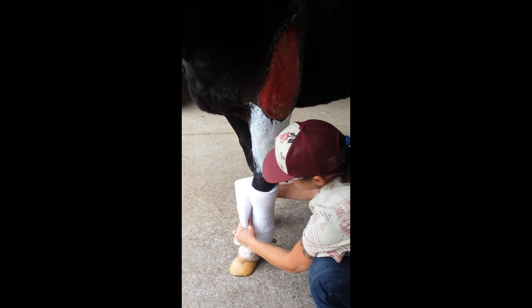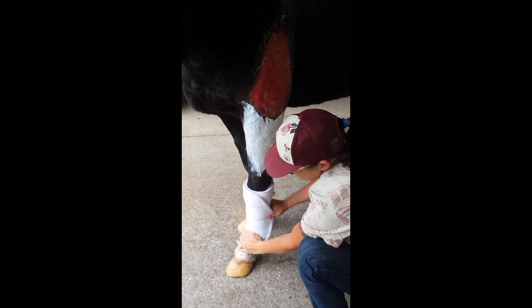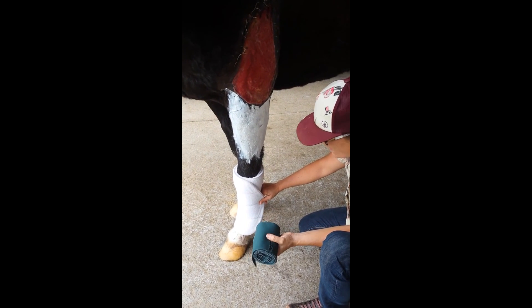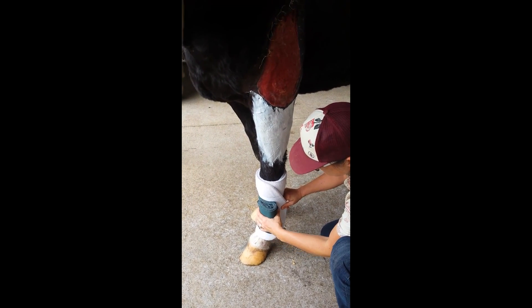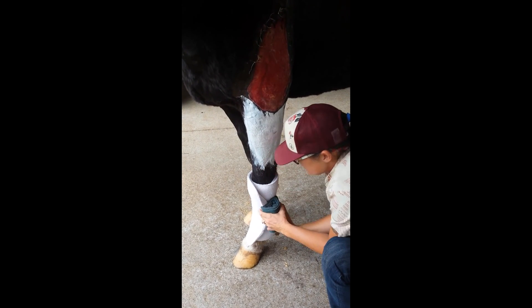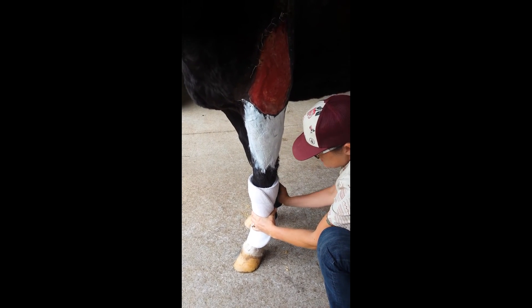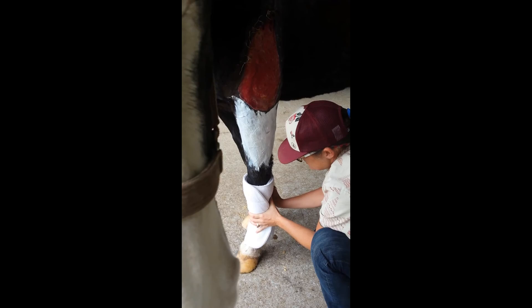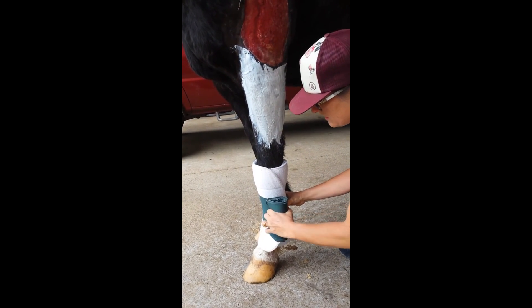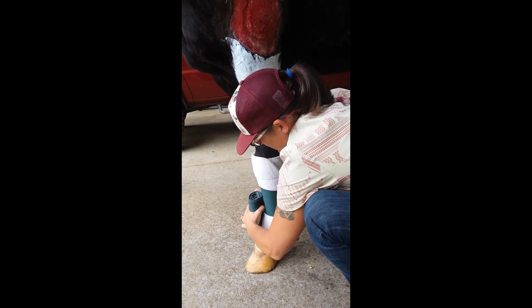Think of it like wearing your socks — you don't want them all bunched up inside your shoe because it's uncomfortable. So the wrap is on nice and smooth. Then I use this, which is called Nylon Track Wrap. You can either start over the top, or some people will tuck the wrap in to help hold it in place. This is where it requires a little bit of dexterity, and practice makes perfect, because sometimes you'll end up dropping the wrap if you're not that familiar with how to do it. You start from the middle and wrap down the leg first.